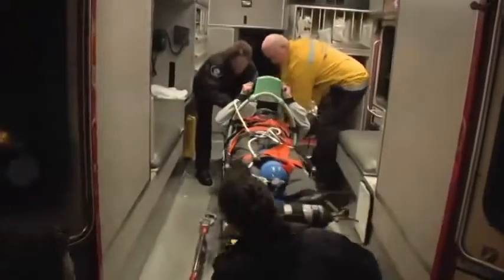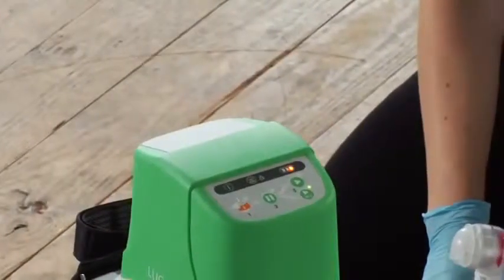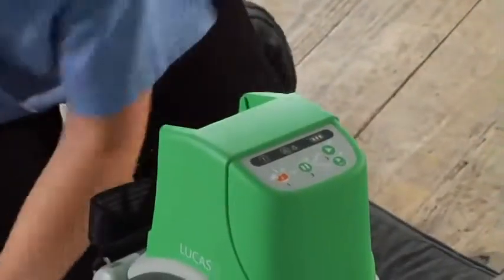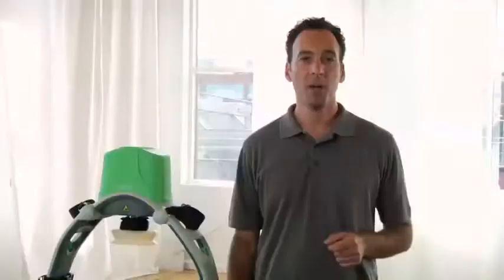During ambulance transport, the patient and rescuer should be secured. Just like with manual CPR, it's common for the patient to have bruising and soreness of the chest with the use of Lucas. If you need to change batteries while using Lucas, push pause, swap in a charged battery, and push active once you see the green LED. Lucas can remember its settings for up to 60 seconds during a battery change — if it takes longer, you'll have to readjust the suction cup before resuming compressions. The same applies when switching to external power. Remember, you always have to have a battery in Lucas even if it is plugged in — it won't run without one.